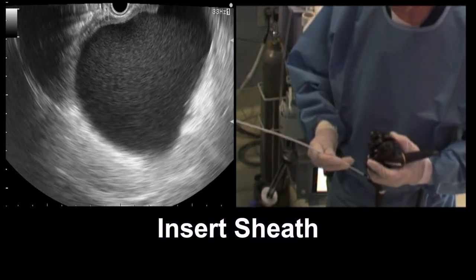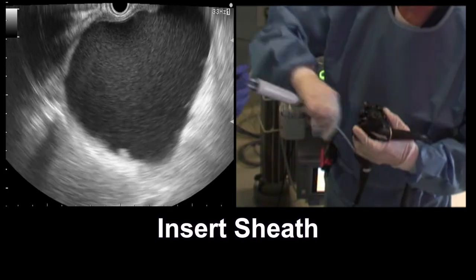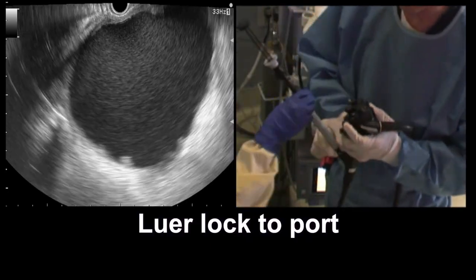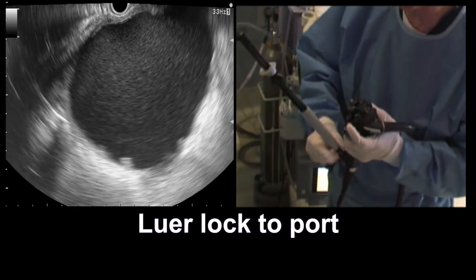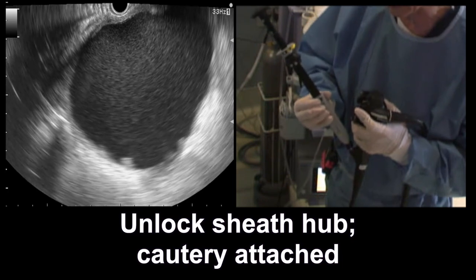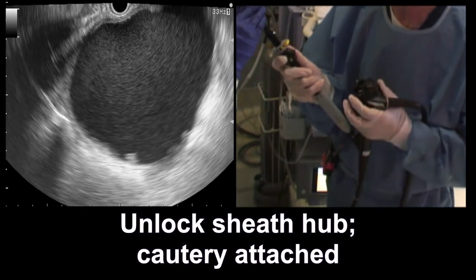We're now going to insert the AXIOS sheath. This is a hydrophilic — we're going to luer-lock this into the port like this. I don't know if you can see that on the room view camera, but we're going to start by unlocking the sheath now and make sure the elevator is nicely open.